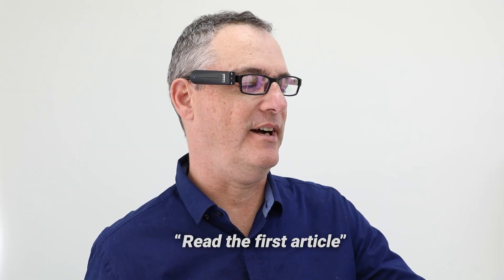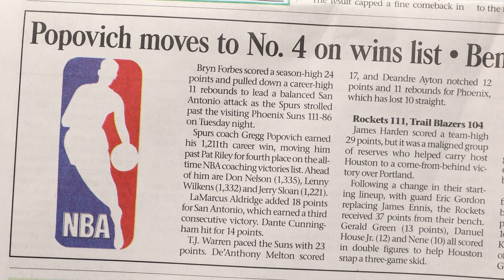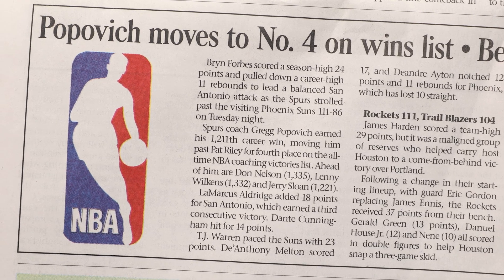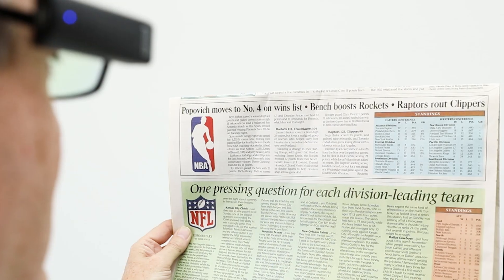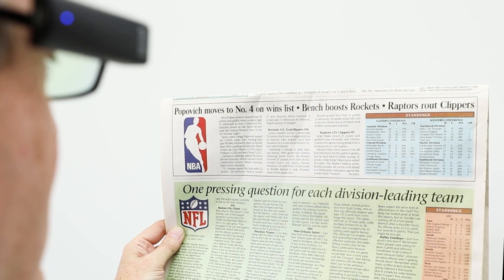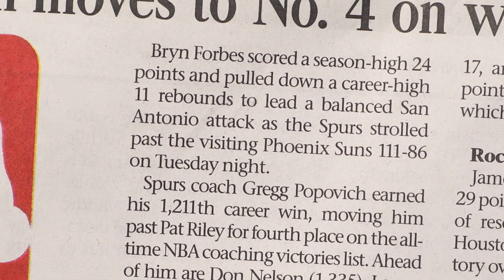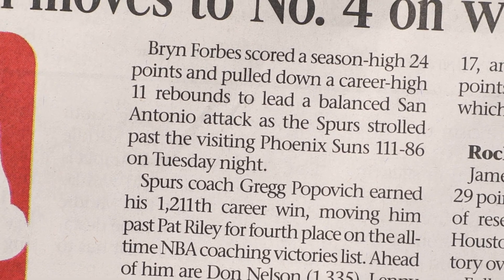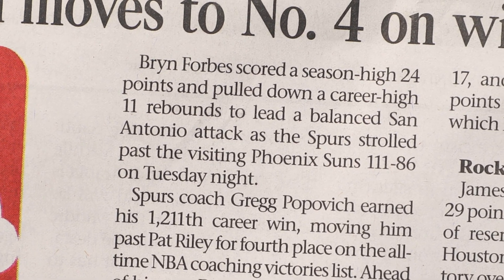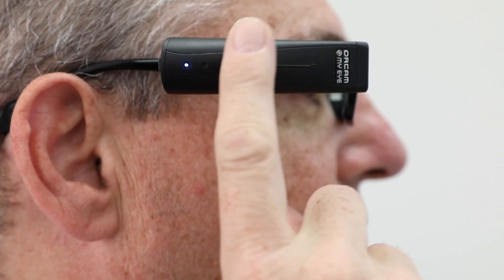Say: Read the first article. The device reads: Popovich moves to number four on wins list. Bench boosts Rockets. Raptors route Clippers. Bryn Forbes scores a season high 24 points and pulled.